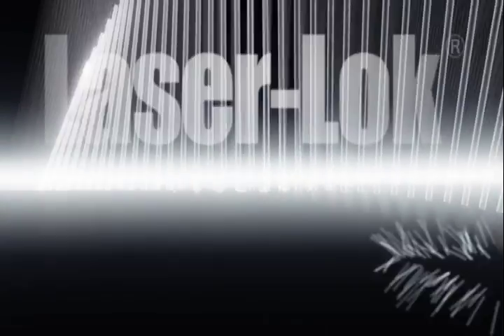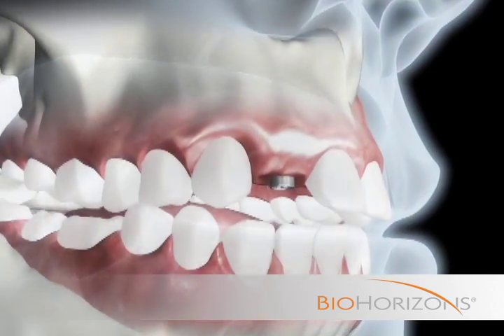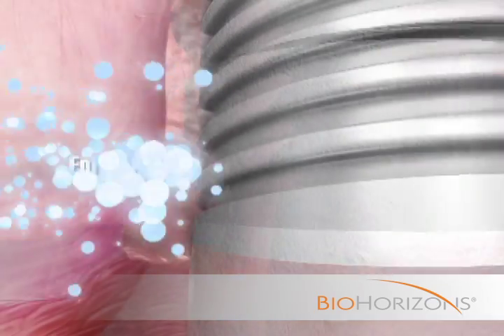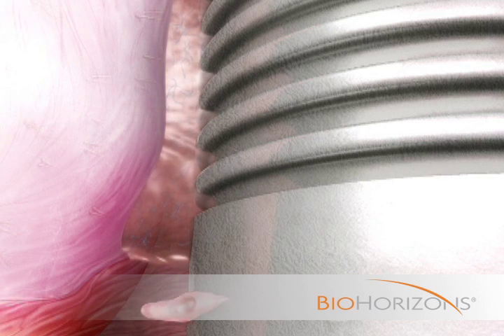BioHorizon's revolutionary laser lock technology is a series of microscopic channels engineered onto the surface of BioHorizon's implants and abutments using a pulsed excimer laser. These unique microchannels are optimally sized to control and organize fibroblasts, epithelial, and osteogenic cells.